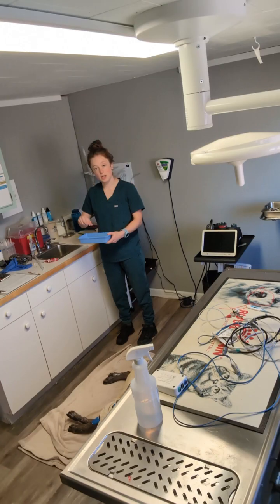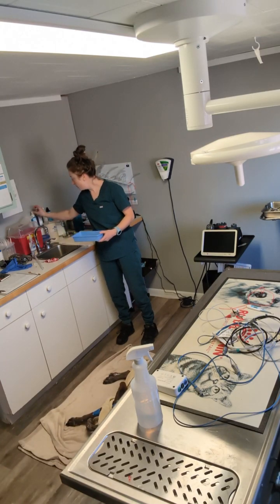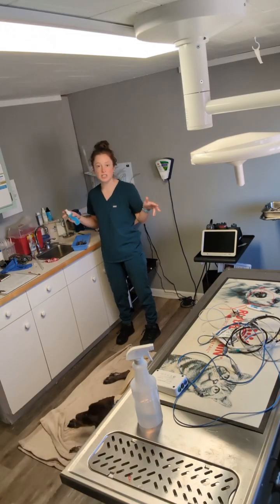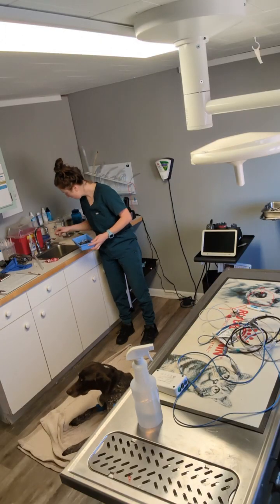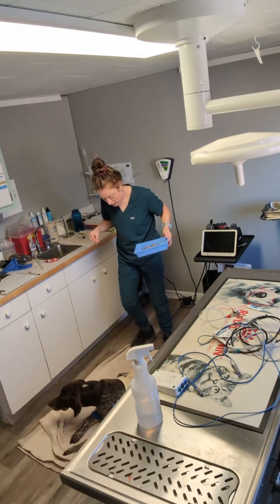I'm gonna soak them in cold water for about 5 minutes, and we just have a little bit of a cleaner that I'm gonna spray in there with the cold water just to help loosen any big debris off of these instruments. How you doing, buddy? Stay there.